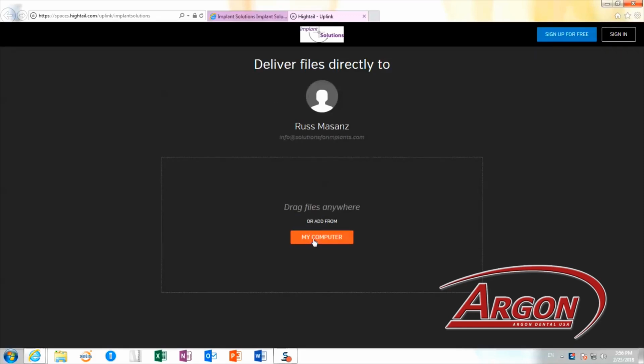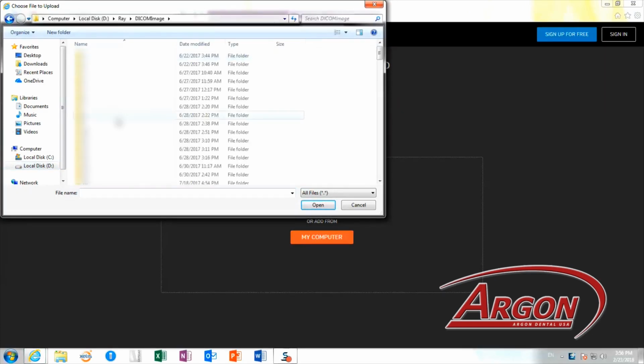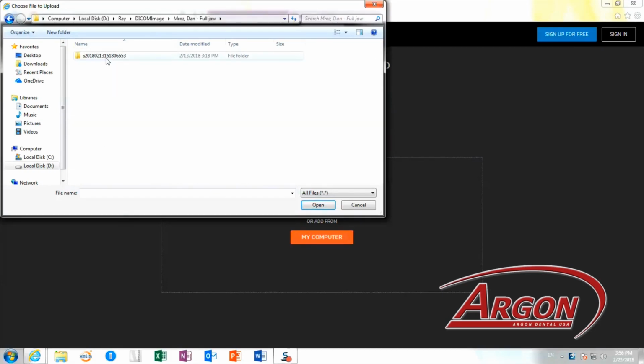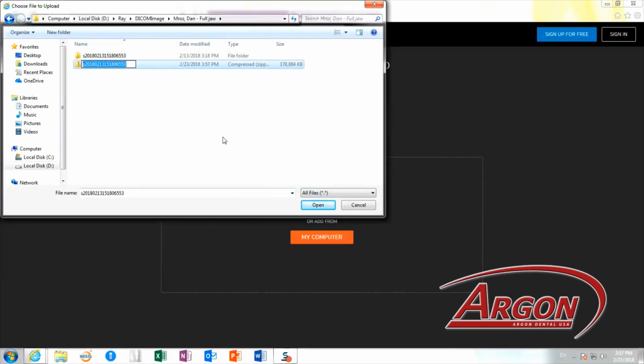In this case, we have our files located on our D drive. And before uploading it to the Hightail website, we're going to compress into a zipped folder. We do that so the files are sent as one and not individual files, because DICOM files can go from anywhere to 300 to 500 files.